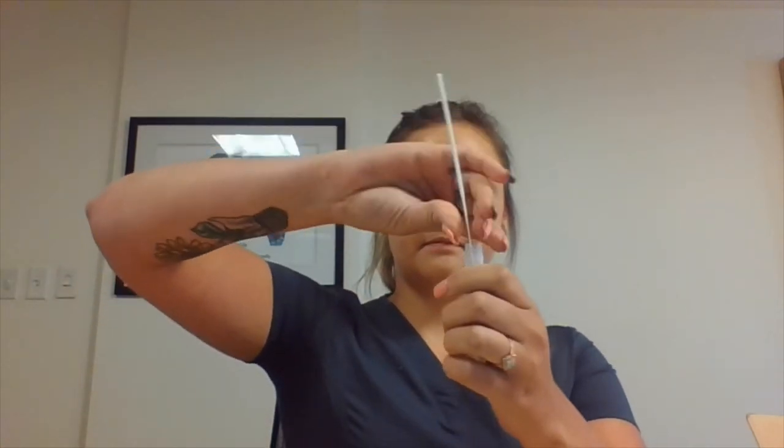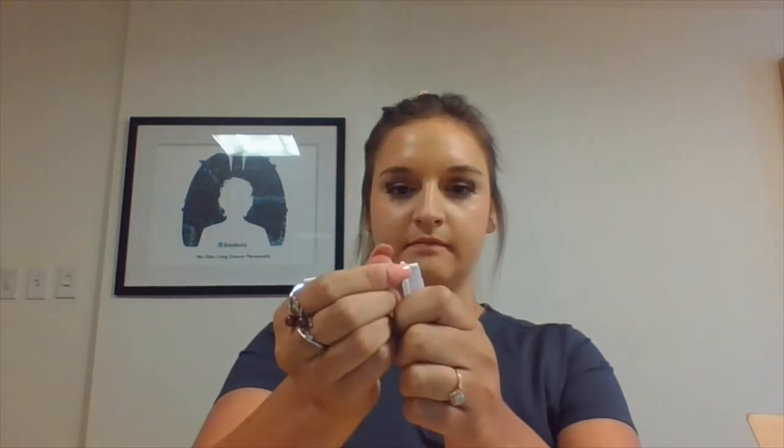Place the swab in the tube provided so that the soft tip is all the way at the bottom. Grab the top of the stick outside of the tube and move it back and forth until it snaps off. This piece can be discarded. Place the cap on the tube and check to make sure it is secure.